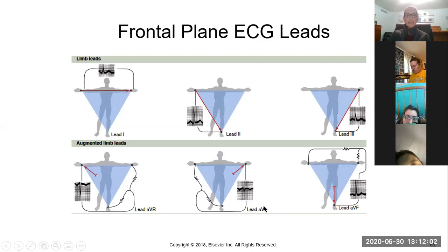Okay, let me tell you that. Bipolar leads: a lead that consists of a positive and a negative electrode. That's what bipolar means. So most leads consist of a positive and a negative electrode. All ECG leads are technically bipolar leads. That's what I was trying to tell you. So leads 1, 2, and 3 use 2 distinct electrodes. We'll keep going here.